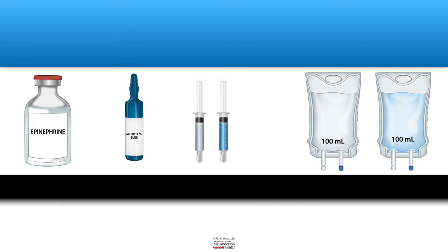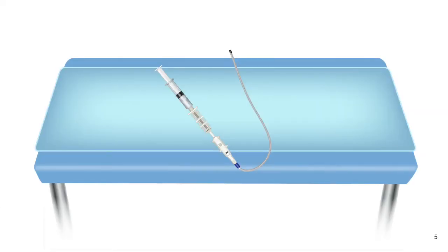So you have your syringe solutions ready, and now you go to the cabinet and pull out an injection catheter that comes in a plastic sheet. You take out the sheet, and this is how an injection catheter looks.